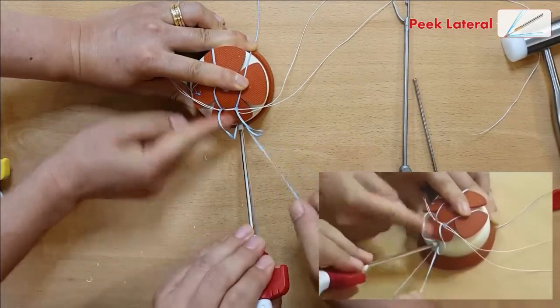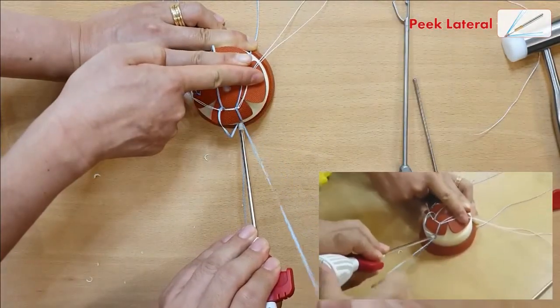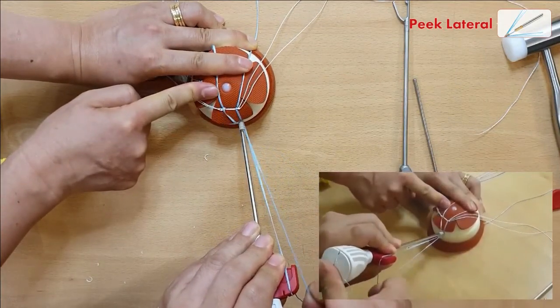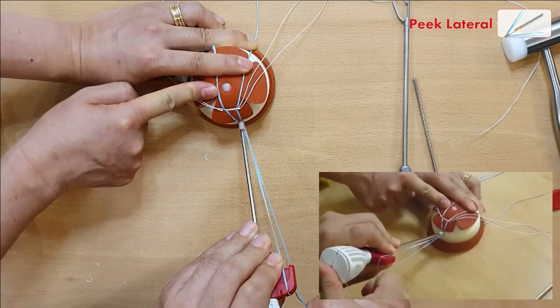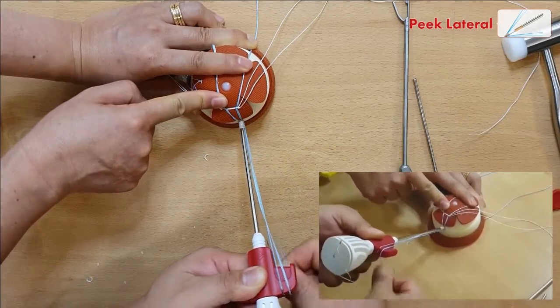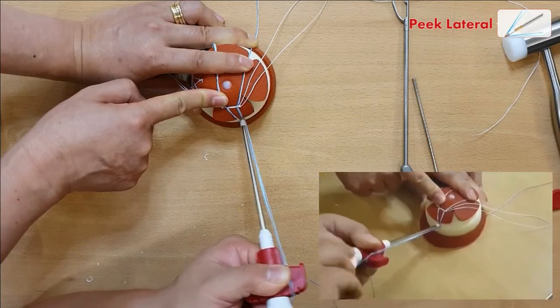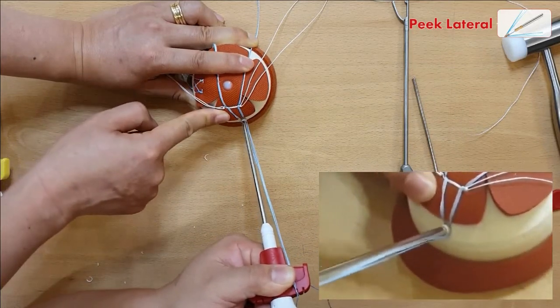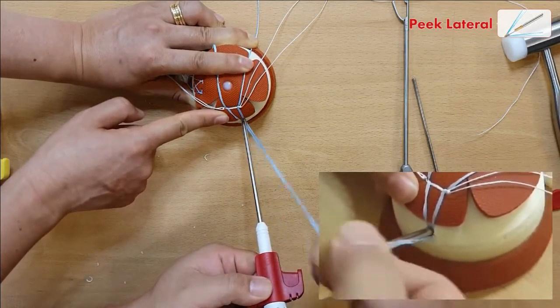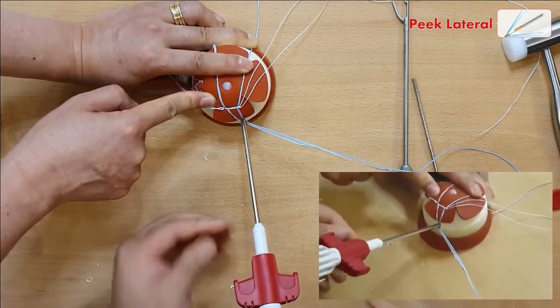Now we're going to pull it to have the tension that you want — this is about how far I want. Just pull it. Lock that up and screw in. There is no more sliding of the fiber tape into the lateral anchor and there is no twisting of the fiber wires. Remove the locking fiber wires on the top.